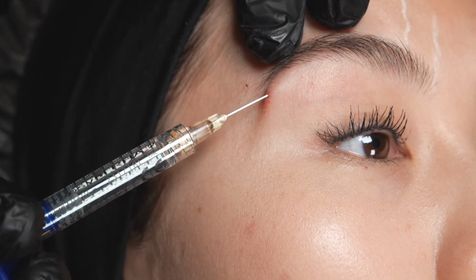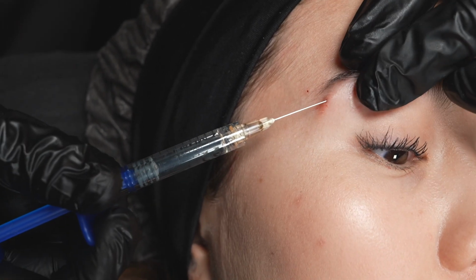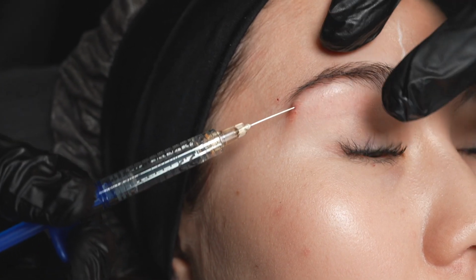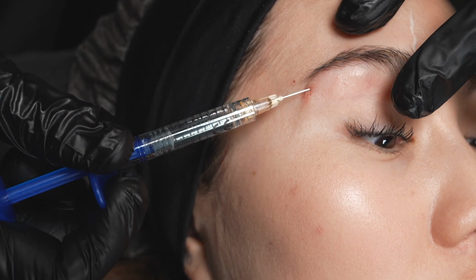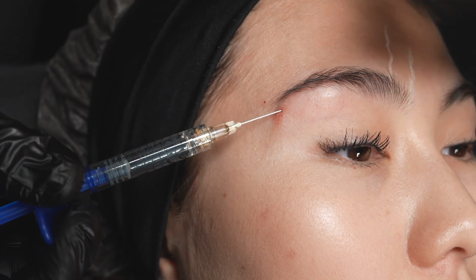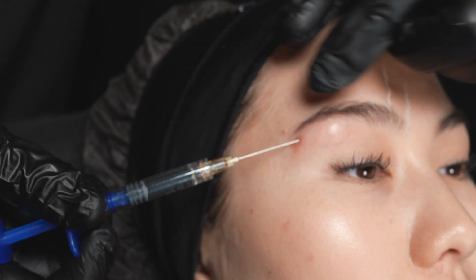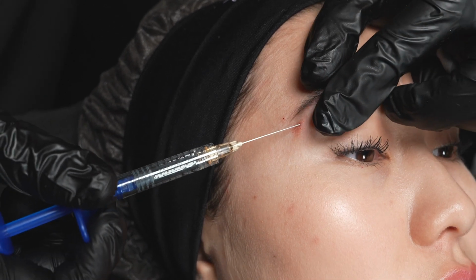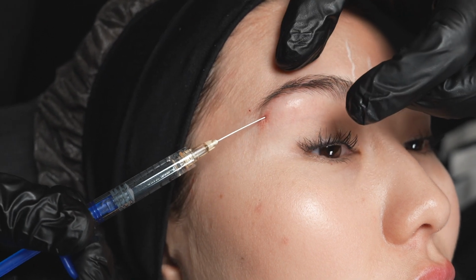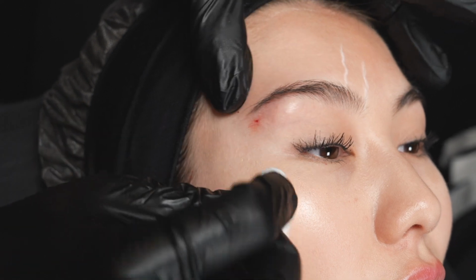Теперь смотрите, нажимаю и ввожу продукт. Почему я выбрала RHA 2? Дело в том, что я не хочу слишком много дать продукта в этой области. Почему? Потому что, как я вам уже сказал, это дает элевационный эффект, ну и потом также избавляет от теней. Наша задача получить максимально естественный эффект. Итак, 0,3 я ввел.